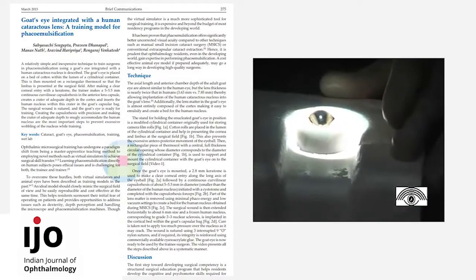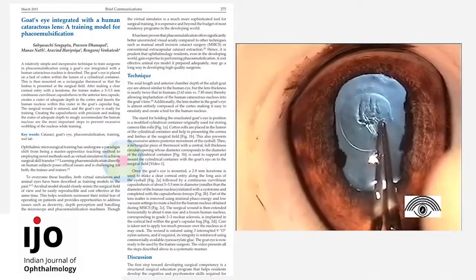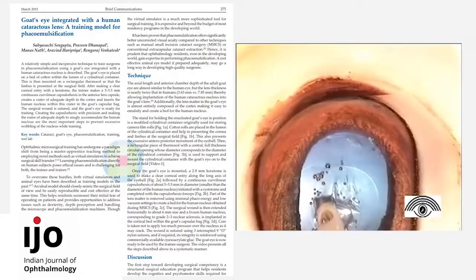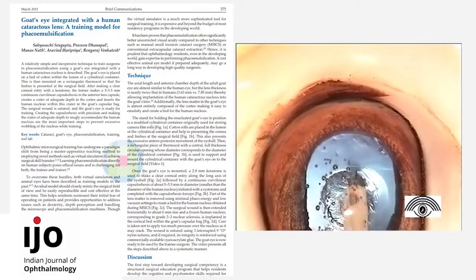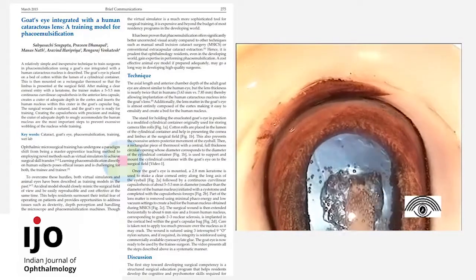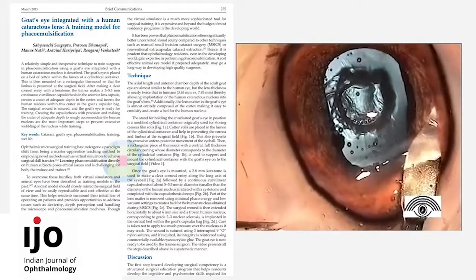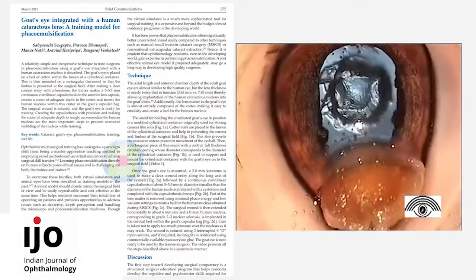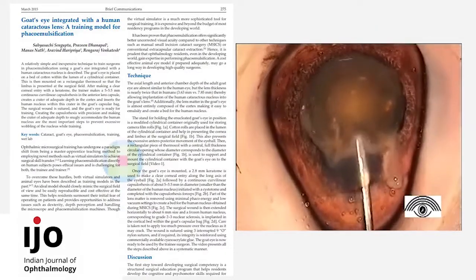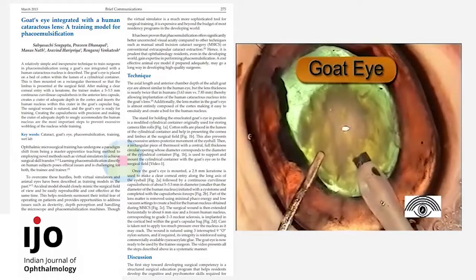Once the goat's eye is mounted, a standard clear corneal incision is made, followed by a 5 to 5.5 mm capsulorhexis, initiated with the cystotome and completed with the capsulorhexis forceps. Part of the lens matter is removed using minimal phacoenergy and low vacuum settings to create a bed for the human nucleus obtained during manual small incision cataract surgery. The surgical wound is then extended to about 6 mm in size, and a frozen human cataractous nucleus is implanted in the cortical bed within the goat's capsular bag. The wound is then sutured, and the goat eye is now ready to be used by the trainee surgeon.